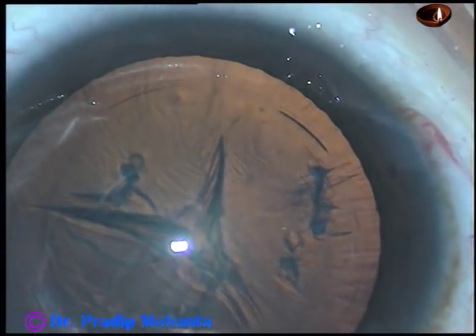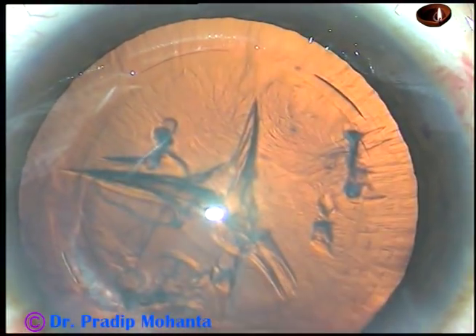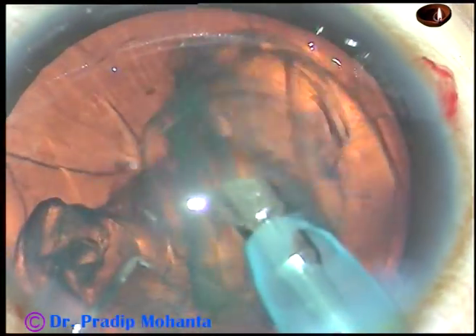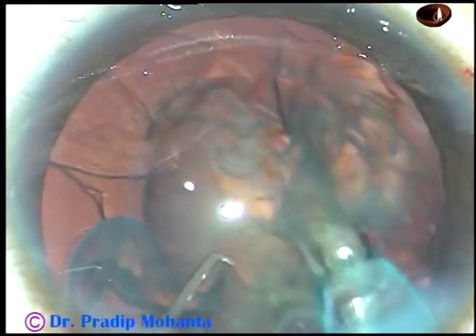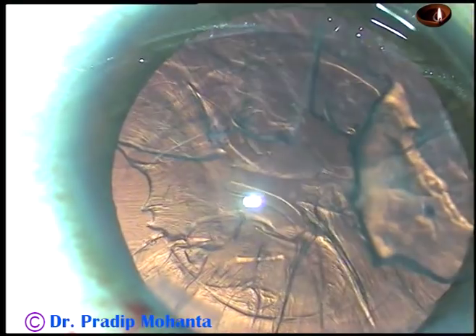Now, introduce the tip of the phaco handpiece with its bevel down and just aspirate the whole mass — just gobble the whole mass. Apply vacuum and very minimal ultrasonic energy, say about 5 or 10% ultrasonic energy, and this whole thing trembles and comes out in a few seconds. This is clear lens removal.